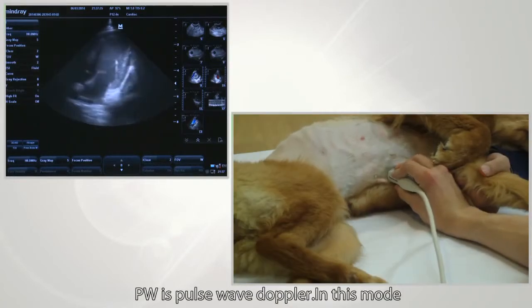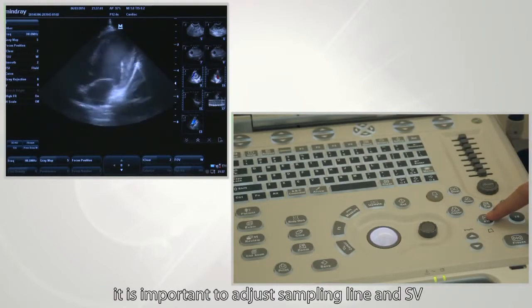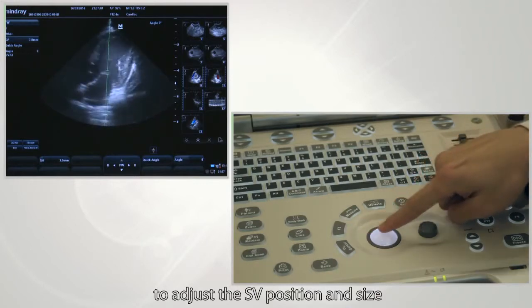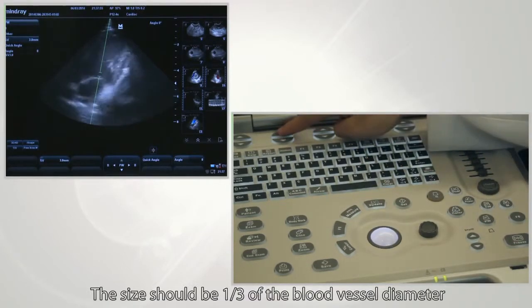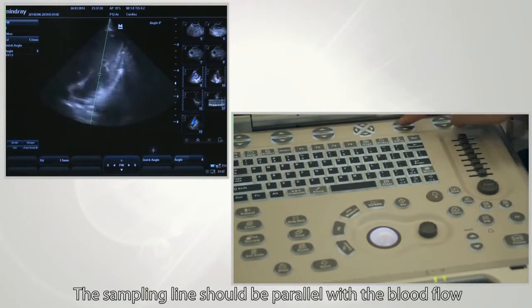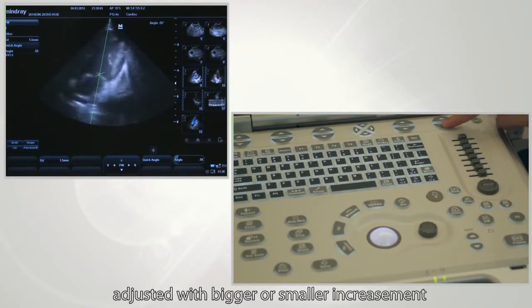PW stands for pulse wave Doppler. In this mode, it is important to adjust the sampling line and SV. Enter PW mode and roll the trackball to adjust the SV position and size — the size should be one-third of the blood vessel diameter. The sampling line should be parallel with the blood flow, and the angle of the sampling line can be adjusted with bigger or smaller increments.